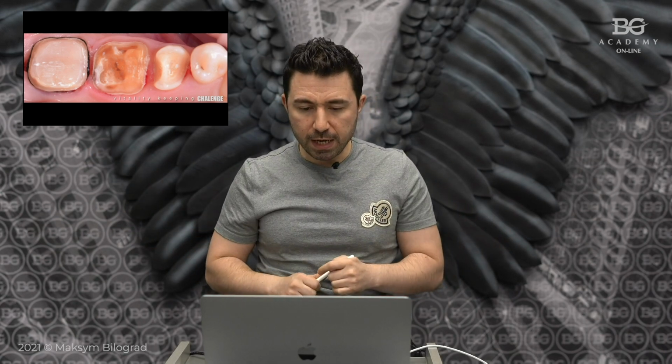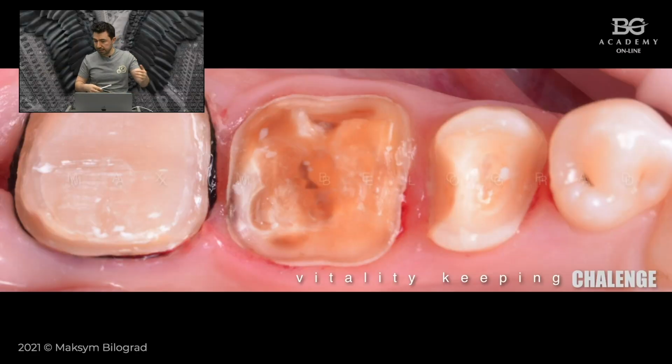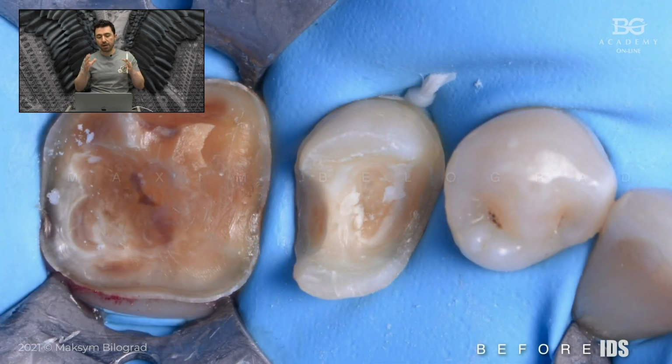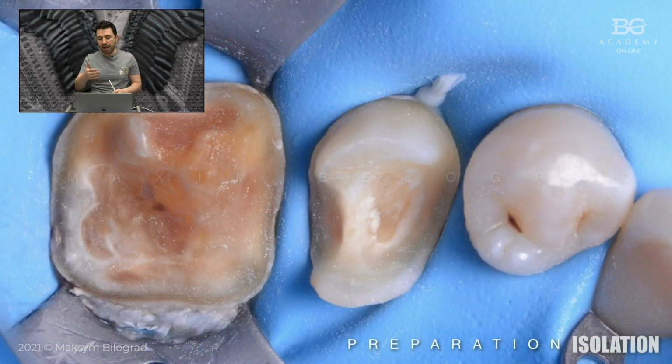So, having information that adhesive dentistry shows very good long-term results in compromised cases also with no ferrule, I decided to choose that technique. So I provided rubber dam isolation. In this case you can see that sometimes it happens that clamps that have pretty wide jaws may leave the gum exposed. Just a small tip: you can pack it with Teflon, for example, or liquid dam, or you can replace the clamp, reposition the clamp, and so on.